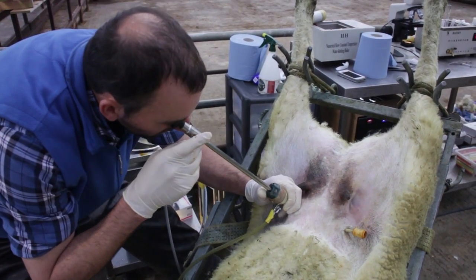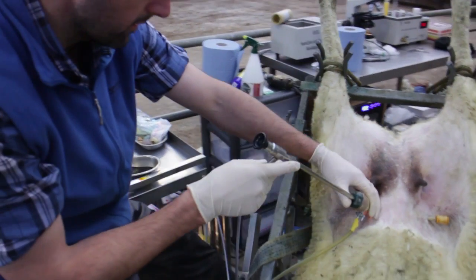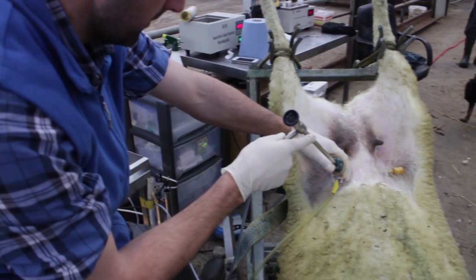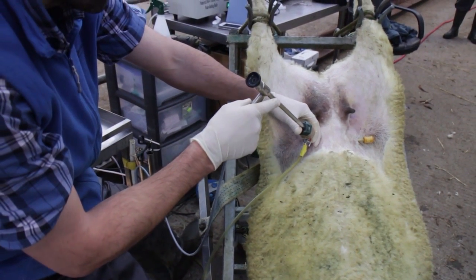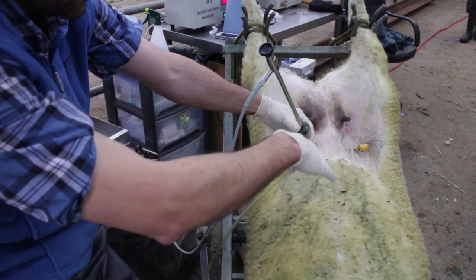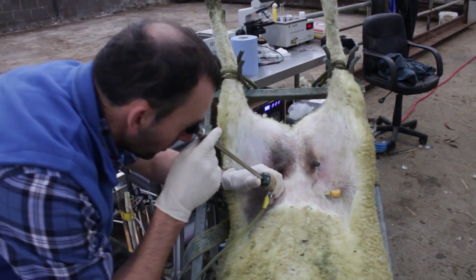The scope goes in here now. We use some gas — controlled by a foot pedal — to displace the stomach, intestines, and bladder out of the way, just to create a bit more space and room inside so we can actually visualise what we want to see, which is the uterus.